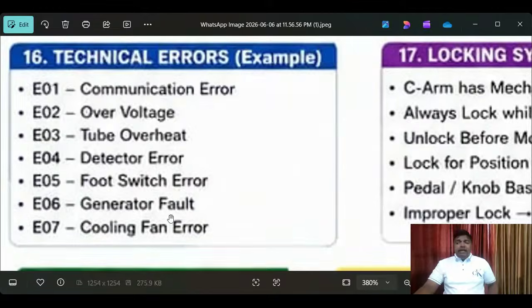These parts may not be visible in the equipment I showed you. For this purpose, I will show you the internal view of the CM, then you can understand and know many parts. I hope you get it very clearly. These are not theoretical, these are all practical parts. For the live session, I try to share them with you, and I have prepared all of this in a practical way.